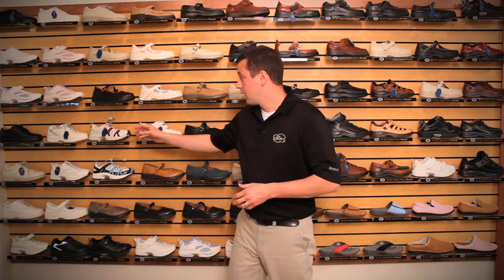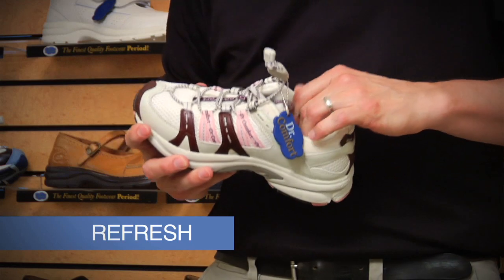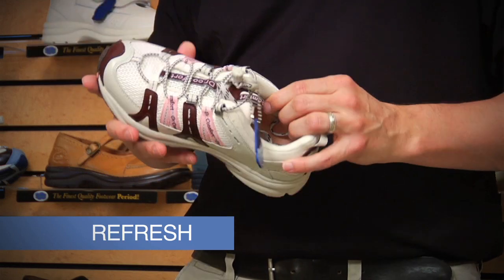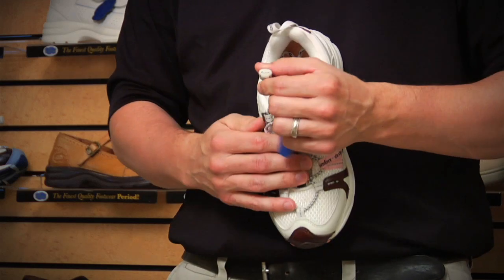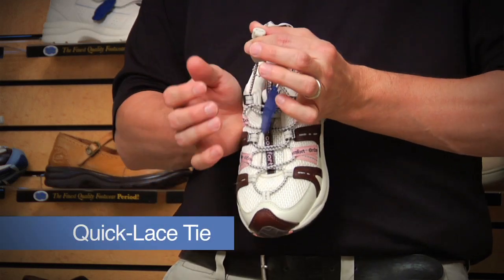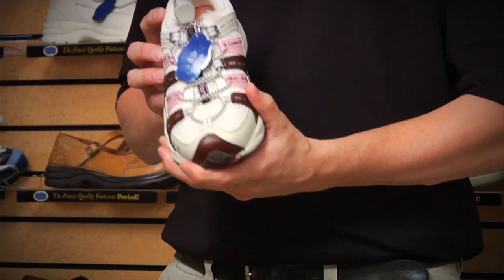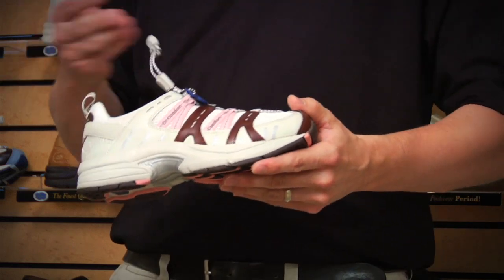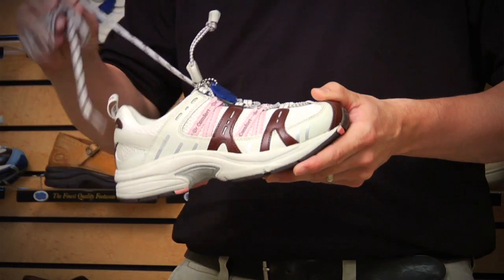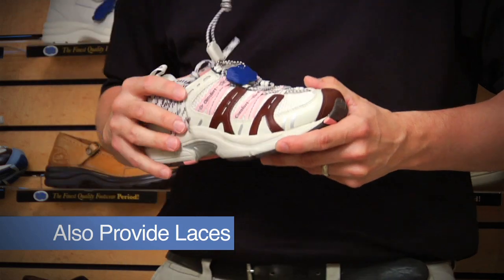Moving along with our different styles of athletic wear, one would be the Refresh. The Refresh is a very popular style by Dr. Comfort, mainly for its overall looks as well as the closure system. The closure system in this case is a quick lacing system with a locking mechanism — you slip it on the patient's foot and quickly lock it into place. However, if the patient is not pleased with that locking system, we also provide a standard set of laces to accommodate those patients.